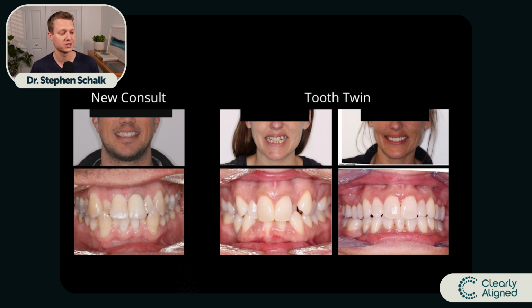When this patient first came in, he told me that he's previously talked to 3 orthodontists, and all of them told him that Invisalign cannot fix his teeth. To me, I think that's kind of a strange statement, right? Because it's not, can Invisalign fix my teeth? Teeth don't know whether they're being pushed against by braces, by Invisalign, by a removable appliance, by your finger with the thumb sucking habit. They have no clue what's actually pushing on them.